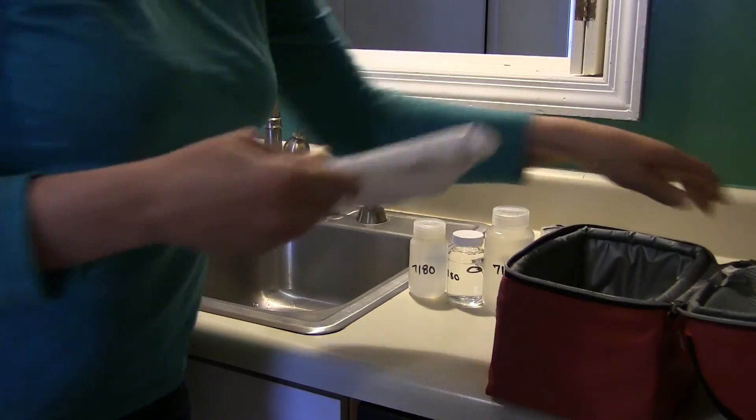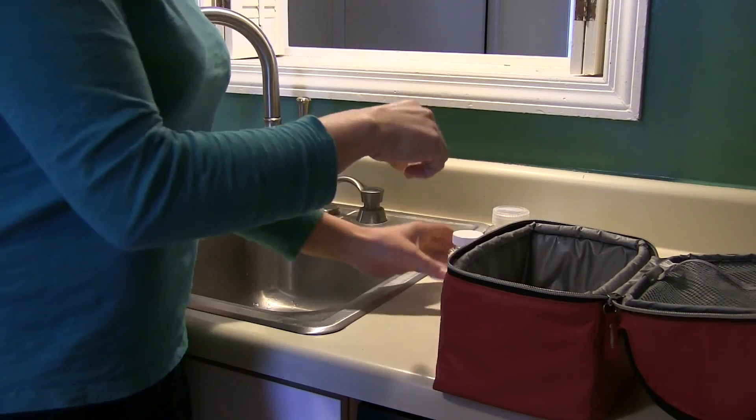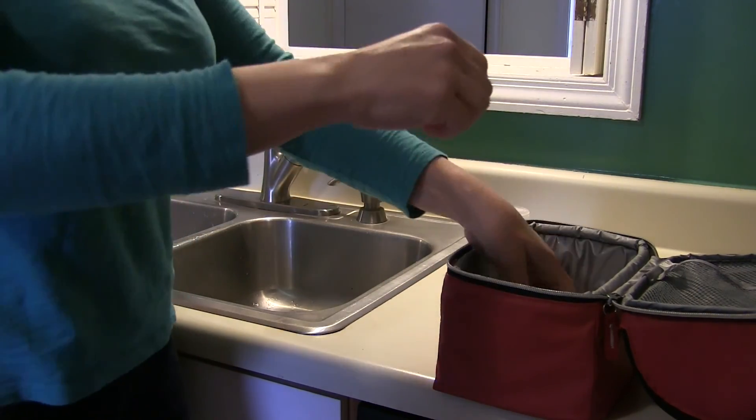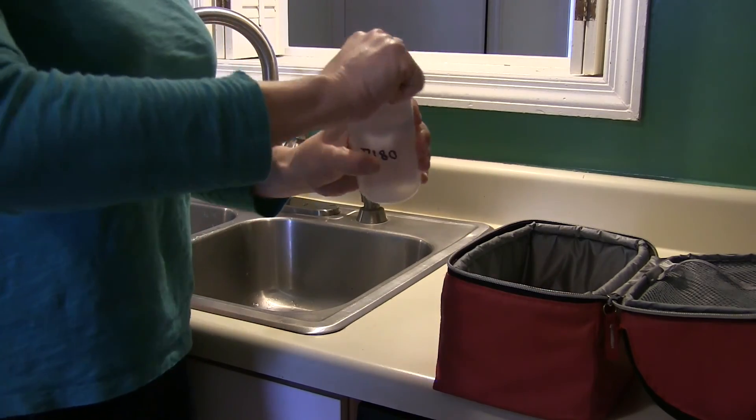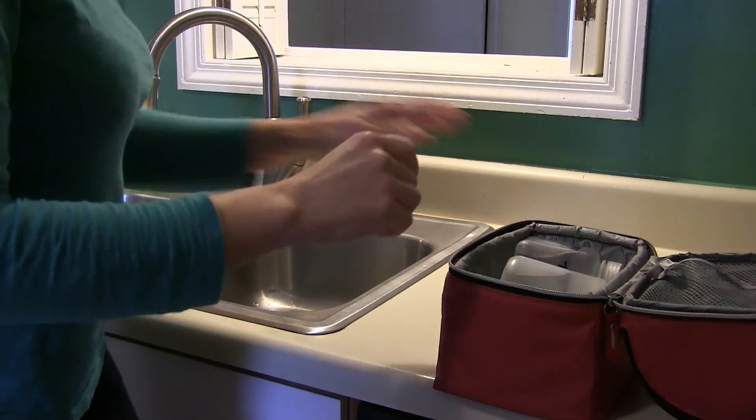Store samples in the refrigerator or on ice in a cooler until you are able to drop them off at the sample collection location. Ensure that samples do not freeze during this time. Bring all four sample bottles along with your completed questionnaire to the sample drop-off site.